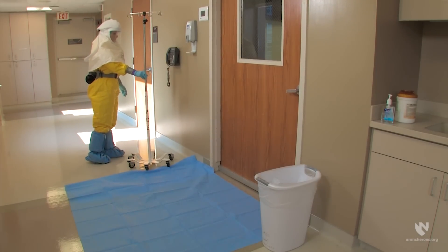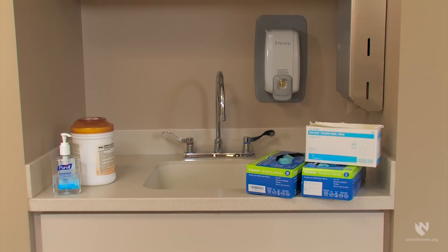The doffing partner then places an IV pole on the far side of the doffing pad, away from the area the healthcare worker will step onto initially. The IV pole will be used to hold the PAPR unit when it is removed from the healthcare worker. The doffing partner will need hand sanitizer, fresh gloves, bleach wipes, and standard masks for the doffing process. The doffing partner must remove gloves, perform hand hygiene, and apply new gloves any time they become contaminated during the doffing process.